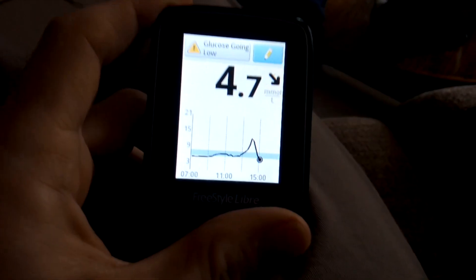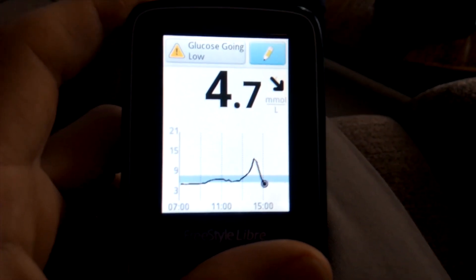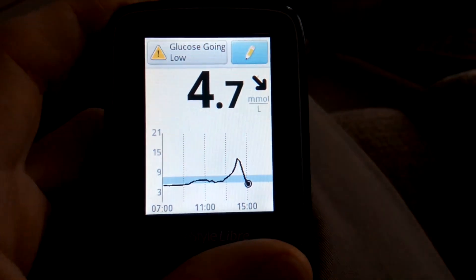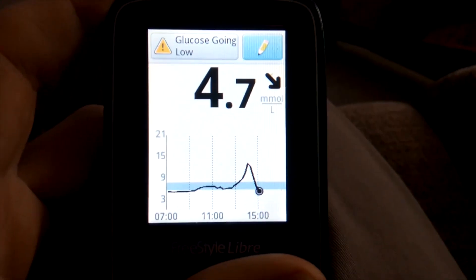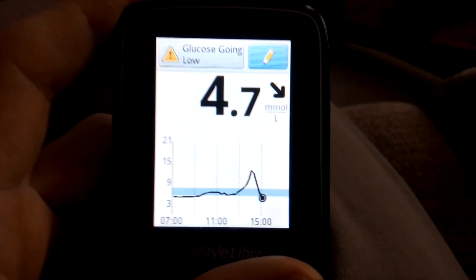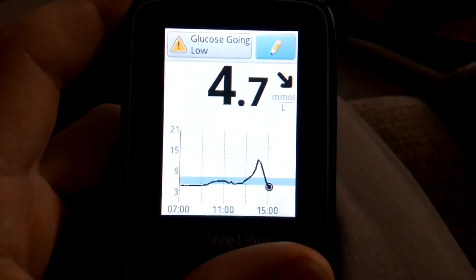Just a quick update about 15 minutes later — it now says 4.7 going low. So it's just a case of being aware of the difference for that short period of time. The Libre is pretty accurate overall, but within that short timeframe after exercise, or doing anything else that causes a rapid blood sugar change, it can be quite inaccurate.